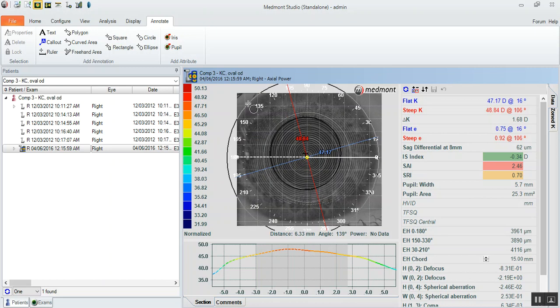So find a spot that looks as close as you think you can be, and if necessary, release it and then move that circle, click on the circle, and center it to the visible iris if your circle wasn't immediately perfectly centered. Then once you release it, it'll give you a VID. In this case, the estimated diameter is around 12 millimeters.